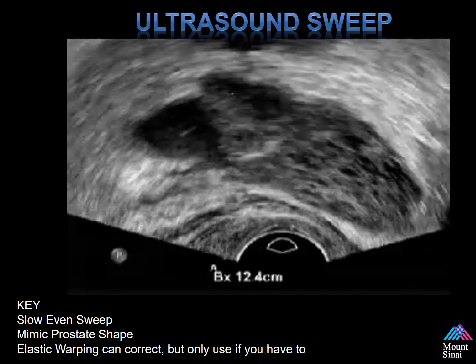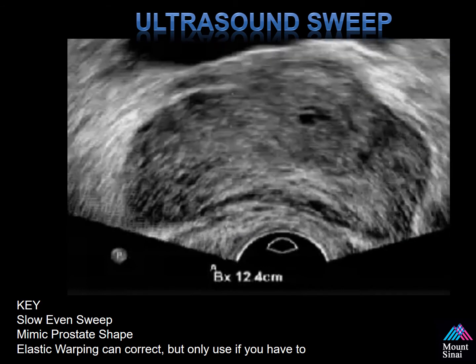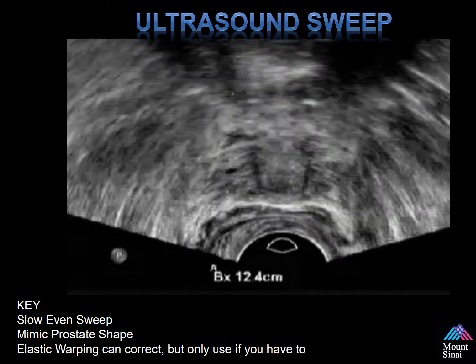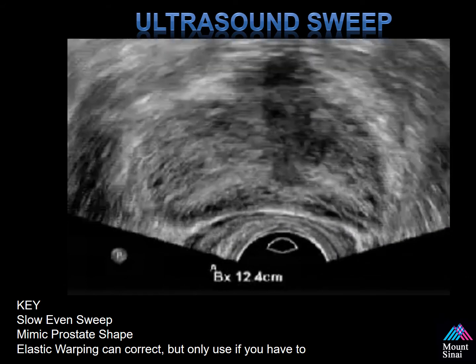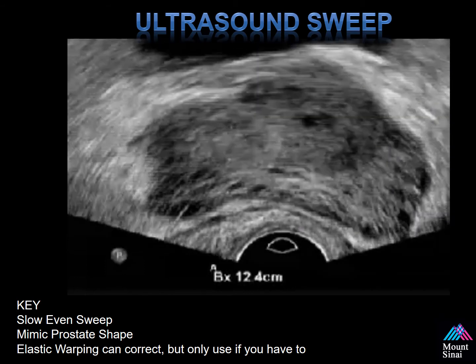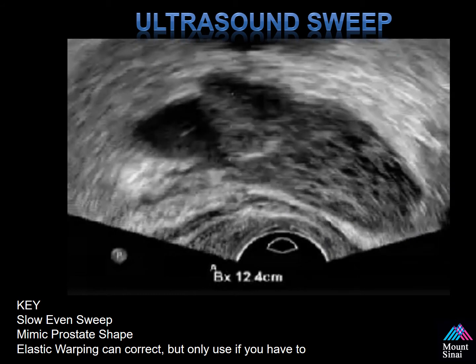This is an ultrasound sweep — you're taking a picture of the prostate. The sweep is important because this is how you obtain the ultrasound data set for surface rendering. Notice how the edge of the prostate is always included within the entire picture. If you cut off a portion of the prostate during your sweep, the surface rendering will not work as well. There is some deformation of the prostate with your probe — you need to minimize this and optimize imaging at the same time. Elastic warping technology can correct this, though I typically prefer to review the raw images from both data sets and do any mental corrections myself.